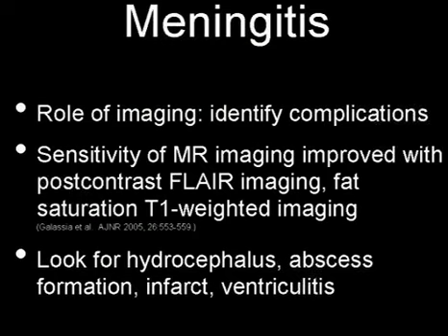And the real role of imaging here is to identify the complications of meningitis as opposed to truly be sensitive for it. There's a significant rate of false negatives, even with contrast-enhanced MR imaging, such that recent research has focused on additional modalities, to see what we can do to increase our sensitivity to the presence of meningeal disease. And what people have found most recently is that some of the modalities that can help us are post-contrast FLAIR imaging and also post-contrast fat saturation T1 weighted images can sometimes increase our sensitivity. But even with these modalities, you may still have some false negatives.